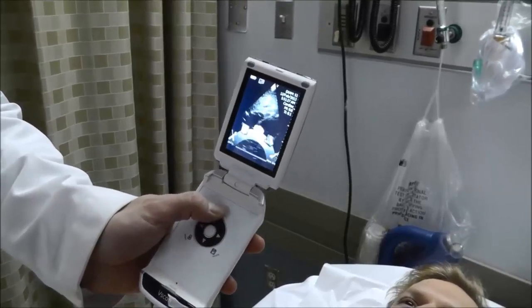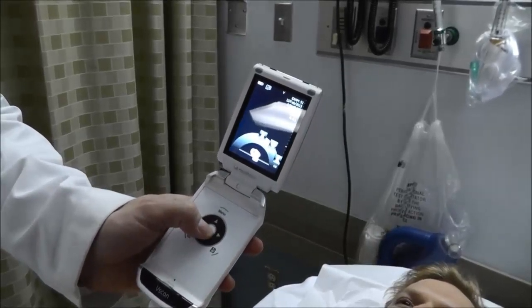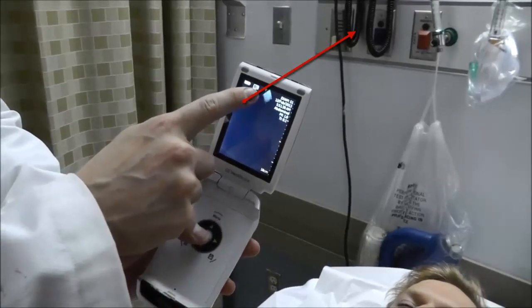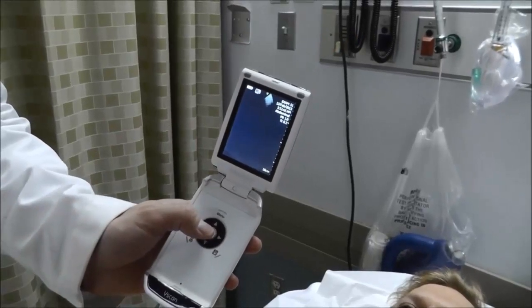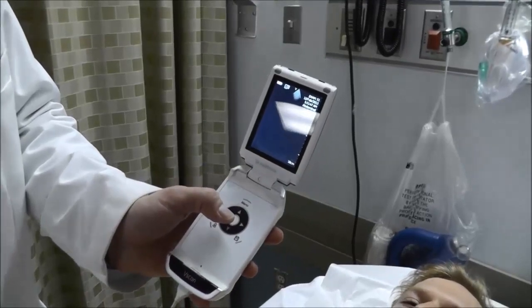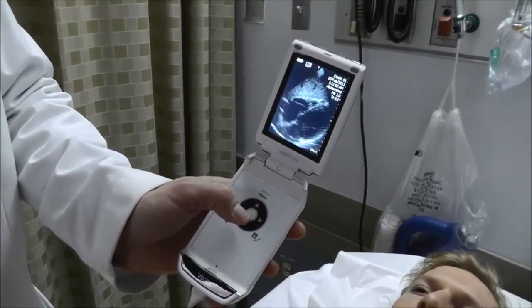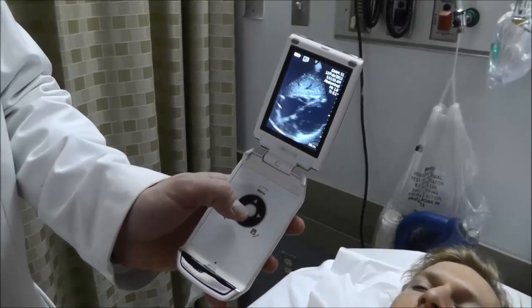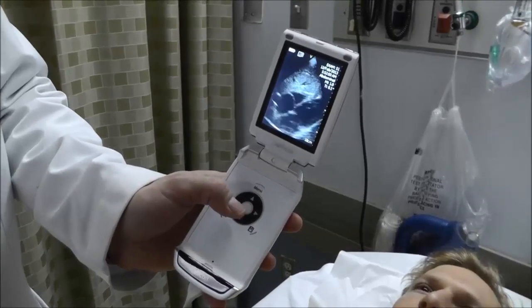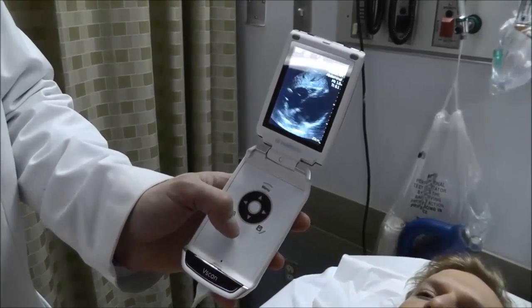I can also obtain the same sub-xiphoid view using the abdominal preset, which in some patients gives a better view. Notice that when in abdominal preset, the V changes to the opposite side of the screen — the V always equals the probe marker. To get this same view in abdomen mode, I need to move the probe marker to the patient's right-hand side. So in abdomen mode, the sub-xiphoid view has the V on the left side of the screen and the probe marker to the patient's right; in cardiac mode, the probe marker faces the patient's left.